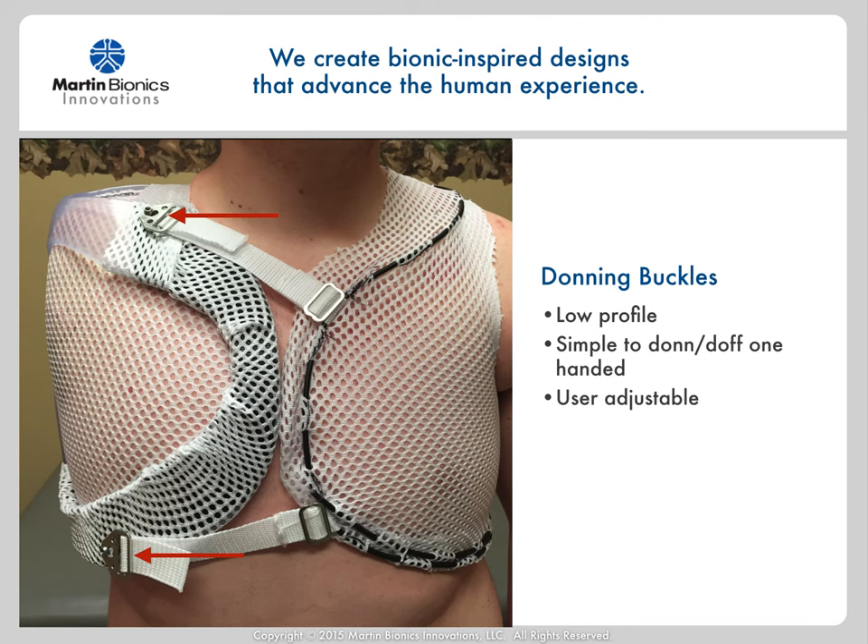We are now using a magnetic buckle closure which makes donning and doffing even easier one-handed. For whatever buckle is used, be sure to connect it securely to where it connects to the fabric socket either by sewing the strap to the force distribution cable or using a secure 3-bar. Likewise, where the strap connects to the buckle itself, make sure that the buckle cannot come undone from the strap so that as the fabric socket is washed, the buckles won't come unwound from the straps.